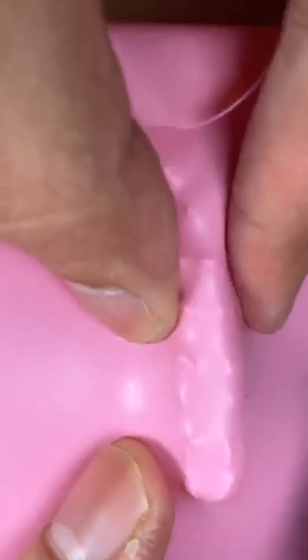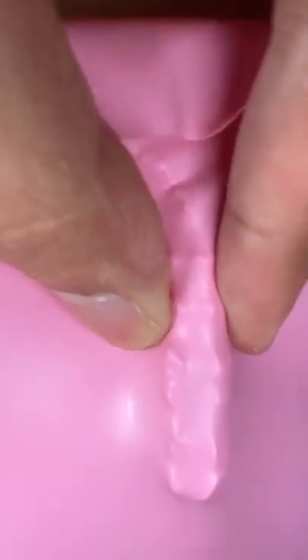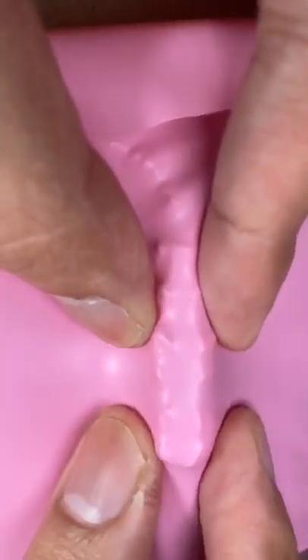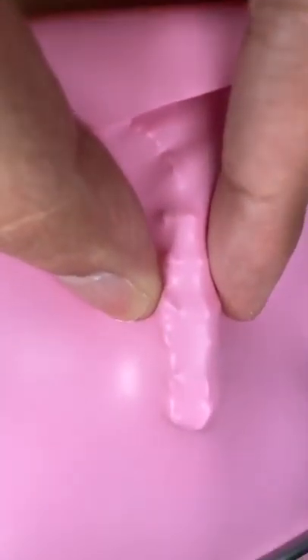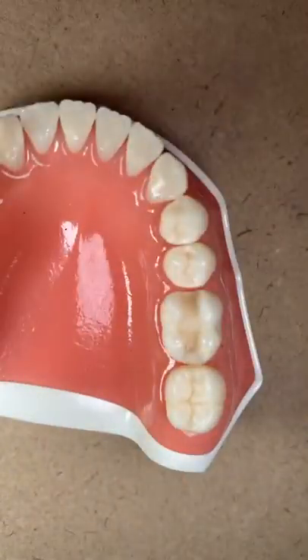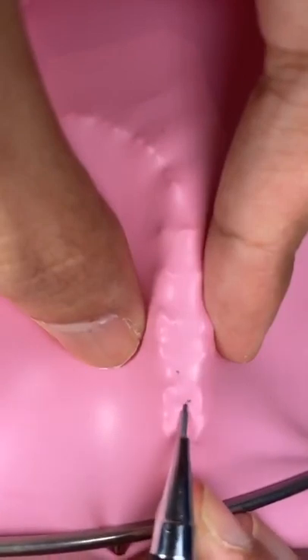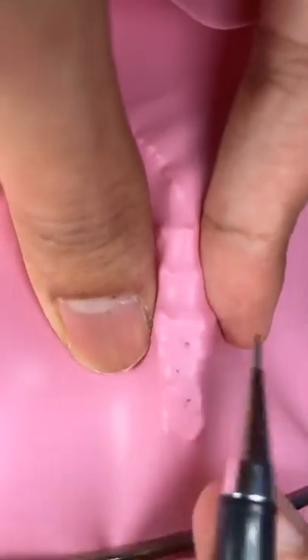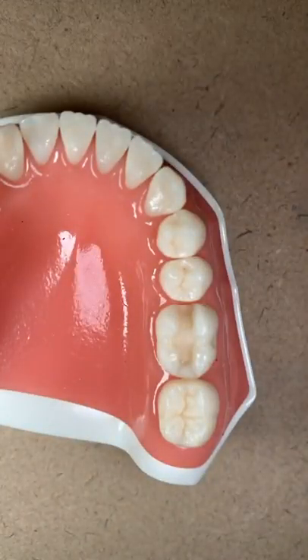The more you isolate, the better the visualization. So make sure you do multiple isolation in every case. Yeah, I will do 3 isolation here. Okay. Just take the pencil and then create a marking in the center of the tooth. And then take your puncher.